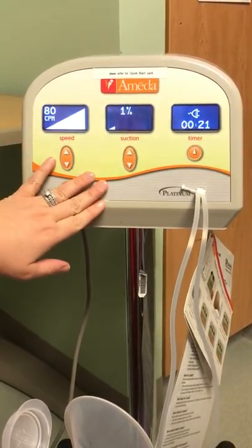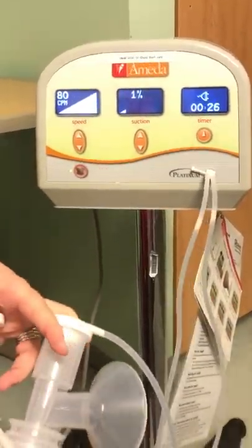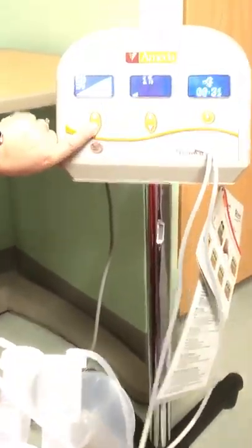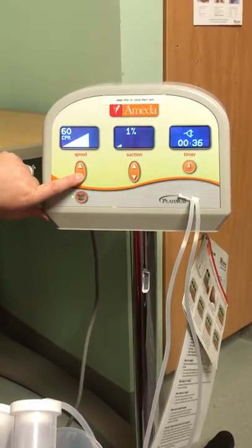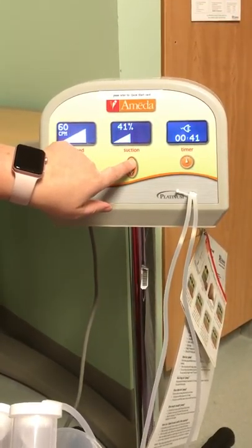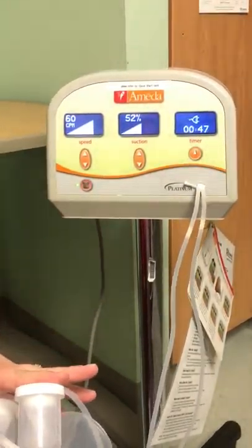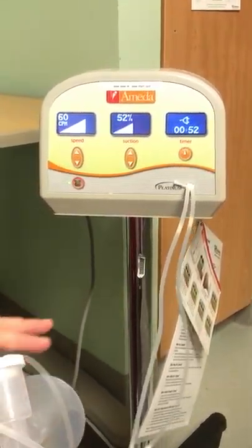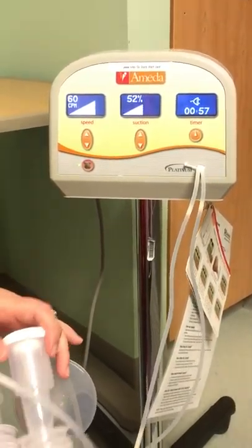The mom will utilize the pump at this speed and suction setting until she gets milk letdown, which is when she'll see milk fall into the bottles. Once there's milk letdown, you need to slow the speed down by holding the down arrow, and then turn the suction up — it goes from one to a hundred percent. The mom would find where she's comfortable, as that action stimulates the way a baby eats once letdown has occurred, helping the pump mimic normal breastfeeding to effectively empty the breast.